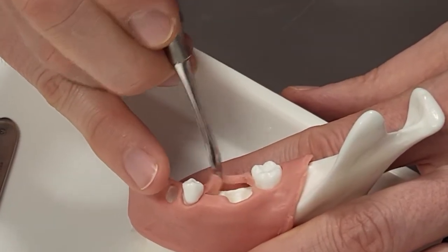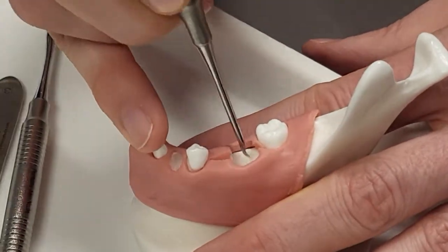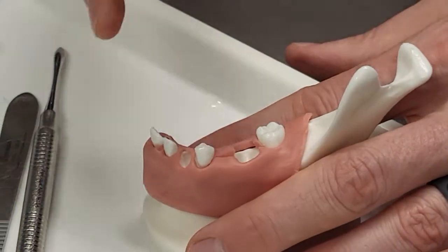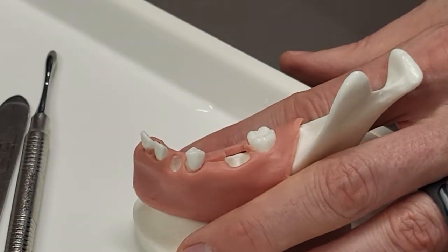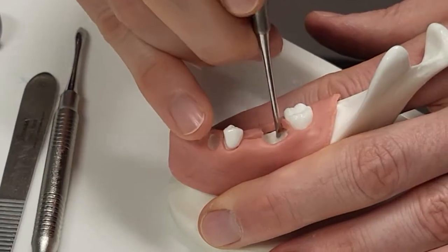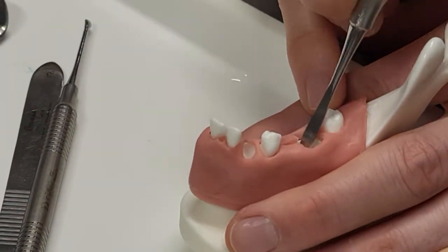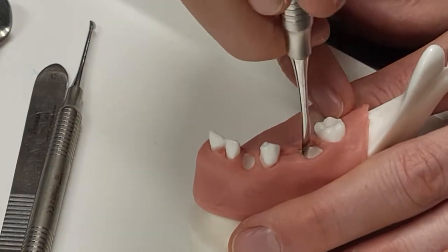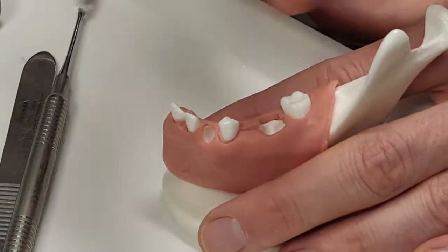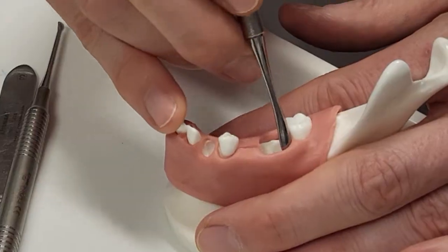So now we're going to scrape the area out really well with the molt. We want good bleeding — if there's no bleeding in there, it's not going to heal very well. You've got to get live blood cells that are going to go in there and populate the bone that we're going to be putting in there. If it's not bleeding already, you'll scrape it. If it's still not bleeding, then I'll take the handpiece in there and kind of buzz around and puncture a couple little areas — judiciously, don't go crazy — but puncture a couple areas, get some bleeding in there. You want it to basically be slowly filling up with heme so that you have active blood cells in that area.